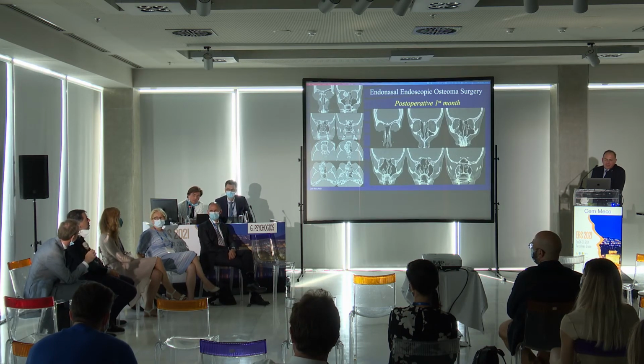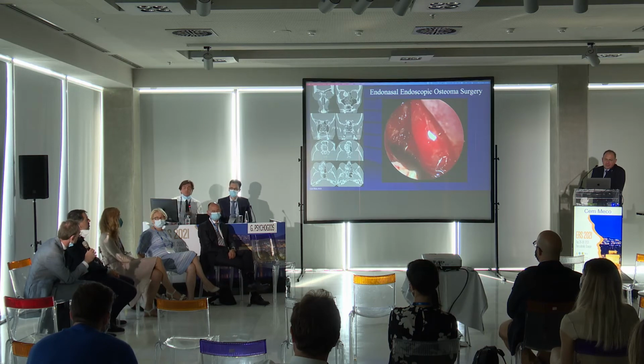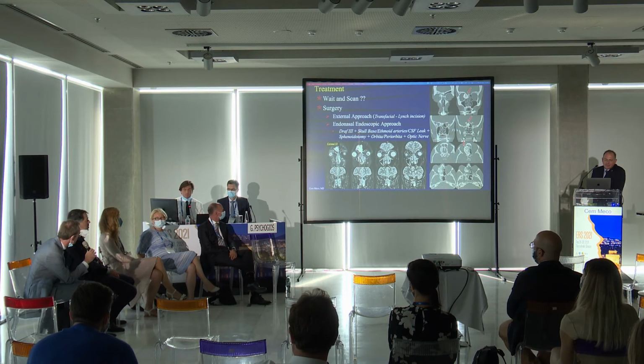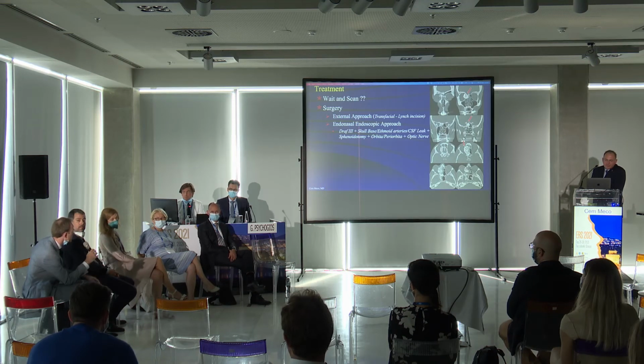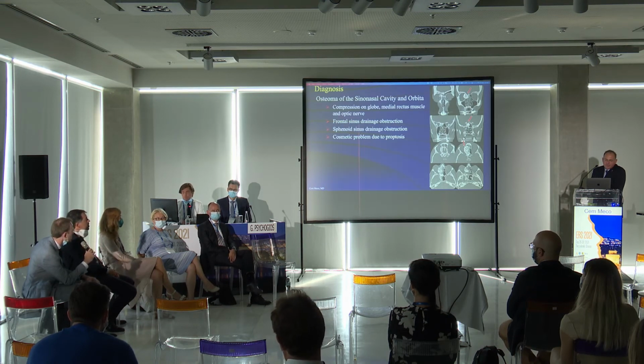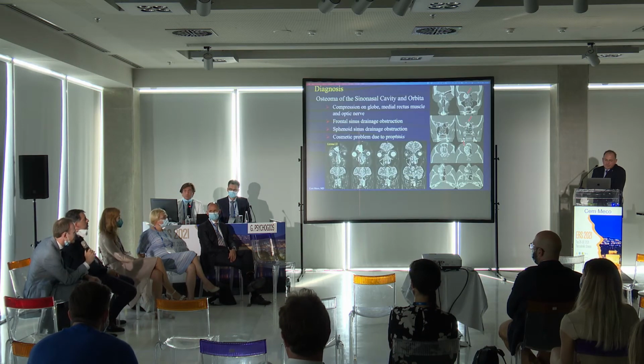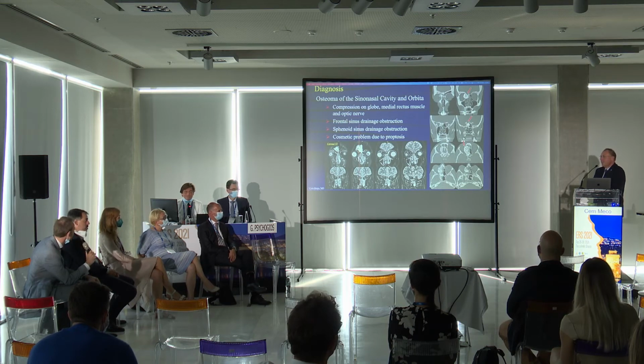Basically, I would follow the lesion. I tell the patient that I am prepared to do it, but only if necessary, and then start debulking and taking it out piecemeal. Sometimes the use of a crushing forceps really helps, because it makes small pieces and saves a lot of drilling time. This is very nice surgery, but how long did you work on it? Even if you go from outside, that will take time, always, because up to the level of the sphenoid sinus and optic nerve, you have to really dissect.